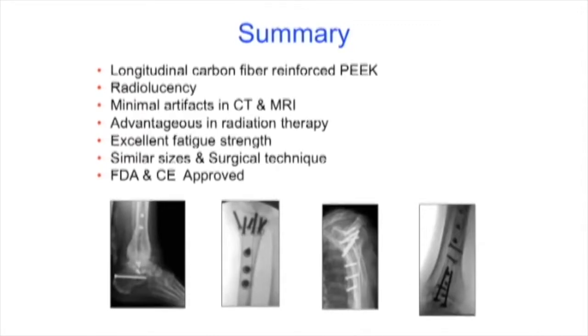Well, there's a couple of reasons. One is I think that the machining of the carbon fiber screws is very, very tough. And I think that's the only reason, but you guys can answer that. It's why they're metal rather than carbon fiber. I was told that the reason why is because the machining of the screws was very challenging for carbon fiber.